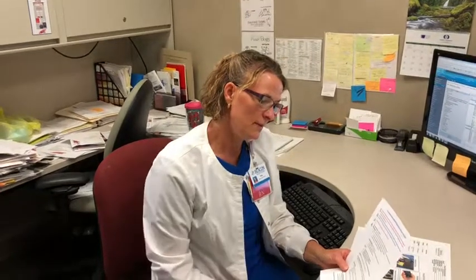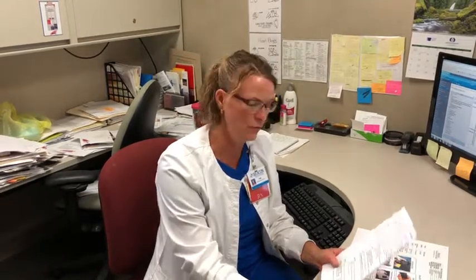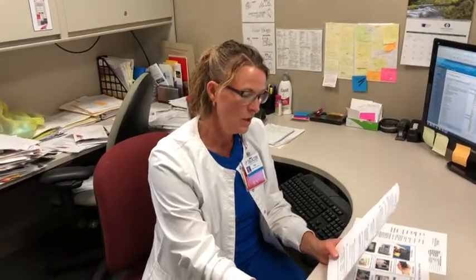Also, you're going to utilize the hypoglycemic protocol as needed, and if they come in with a continuous glucose monitor, whether it's associated with the pump or not, hospital policy is we treat only to the AccuCheck Inform 2 glucose meters. We can't use the CGM as treating or dosing insulin. It's not FDA approved.